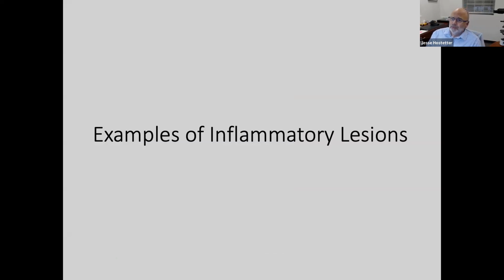So what I'm hoping we'll do is I'm going to show you 2 or 3 images from cases I've had. These were digitized cases that I read for GI Lab over the last few years. And if you just want to shoot in a couple, 1 or 2 changes that you see, changes we've talked about in the last hour, into the Q&A, just make this as interactive as we can. Me talking to you from Georgia to Australia.